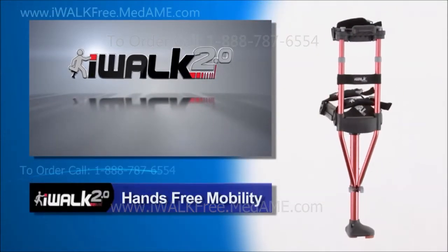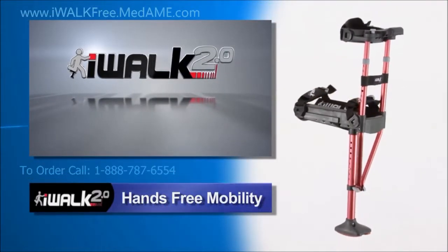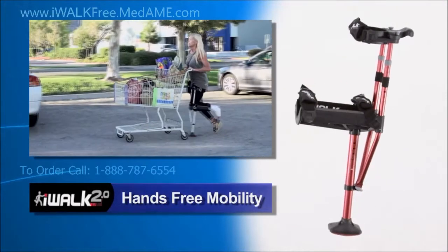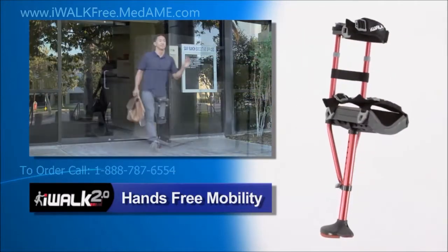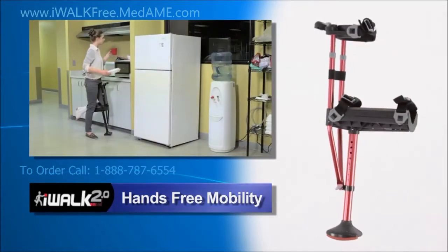The amazing iWalk 2.0 crutch gives you the freedom and pain-free mobility never before available. Now there's no more hand, wrist, or underarm pain and you can go about your day-to-day routine with ease.